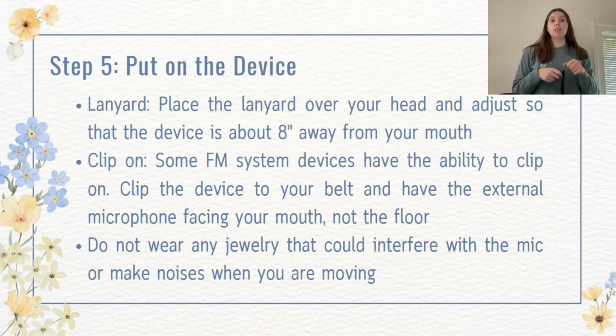If it is external, you're going to take the mic and you will clip it onto your shirt. And you should make sure that the mic part is facing towards your mouth so that the student can hear you clearly rather than towards the floor, which will make it much harder for them to hear you.